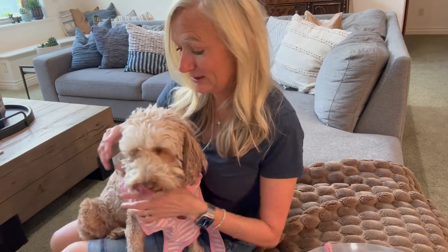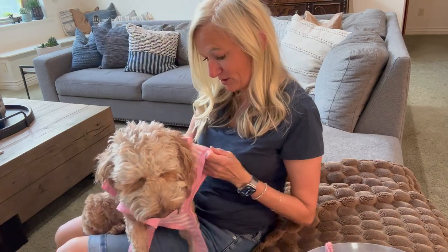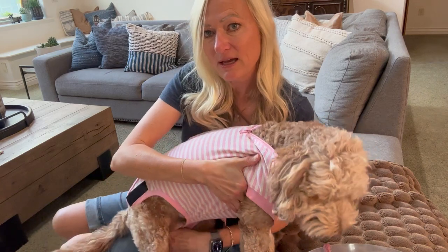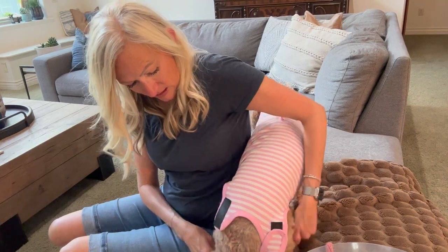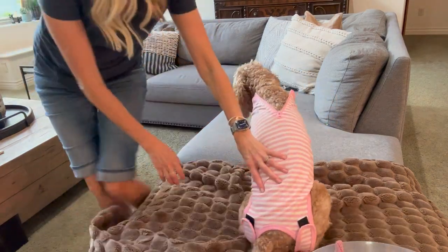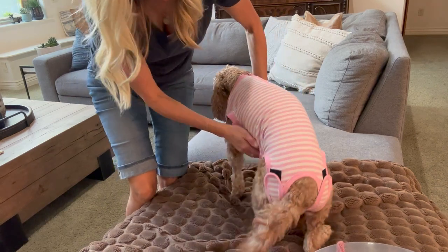She looks so cute in it, like a little baby — it's like dressing your kid again, one arm through at a time. It has velcro on the back and it goes underneath, which covers up her incision. She really doesn't mind wearing this suit that much, and look — her little tail sticks out. Her incision is 100% covered and she can't get to it.